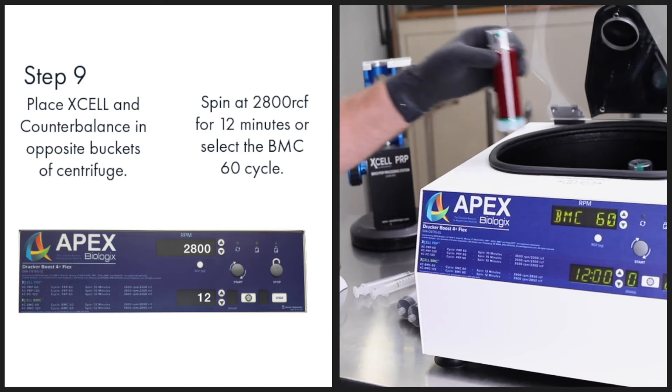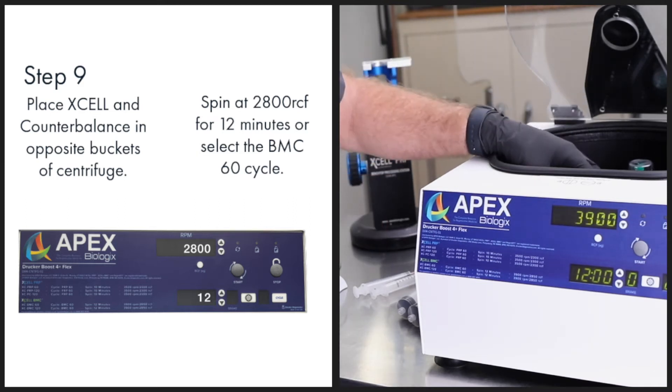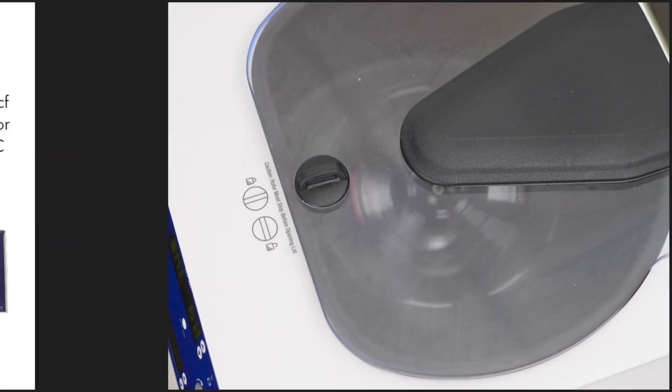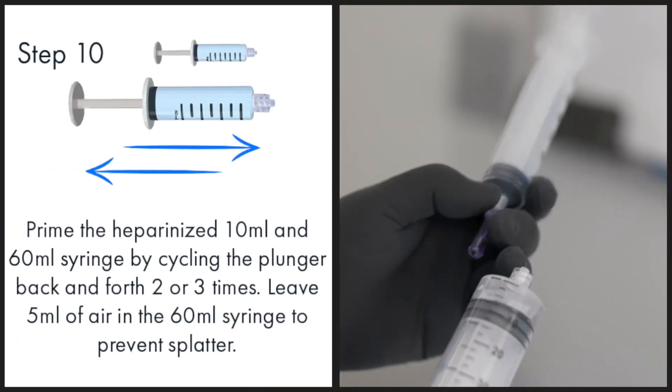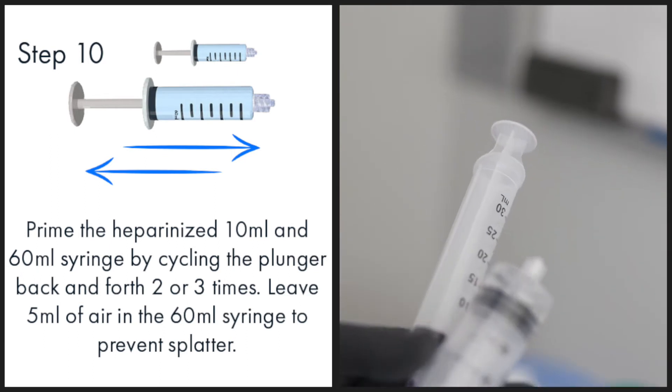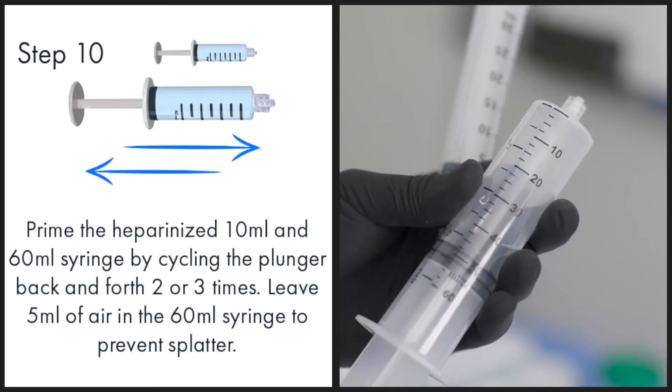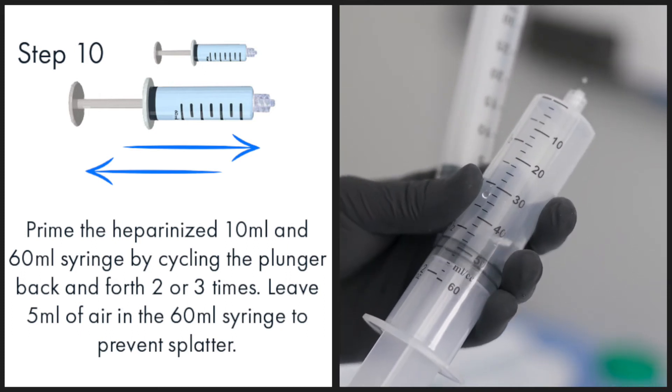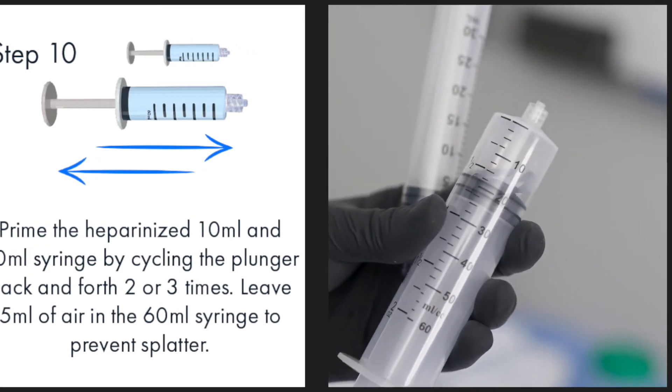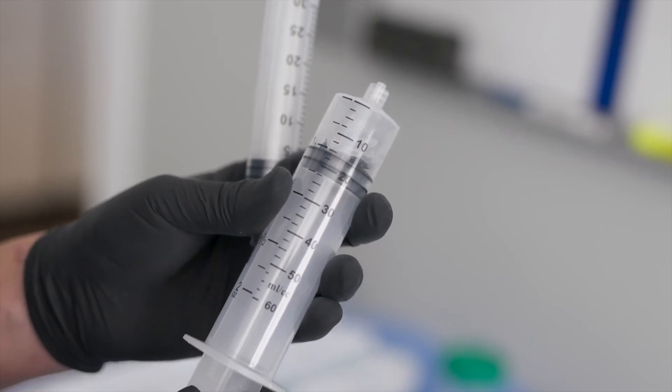Spin at 2800 RCF for 12 minutes or select bone marrow concentrate 60 cycle on the centrifuge. Prime the heparinized 10 milliliter and 60 milliliter syringe by cycling the plunger back and forth two to three times. Leave five milliliters of air in the 60 milliliter syringe to prevent splatter.